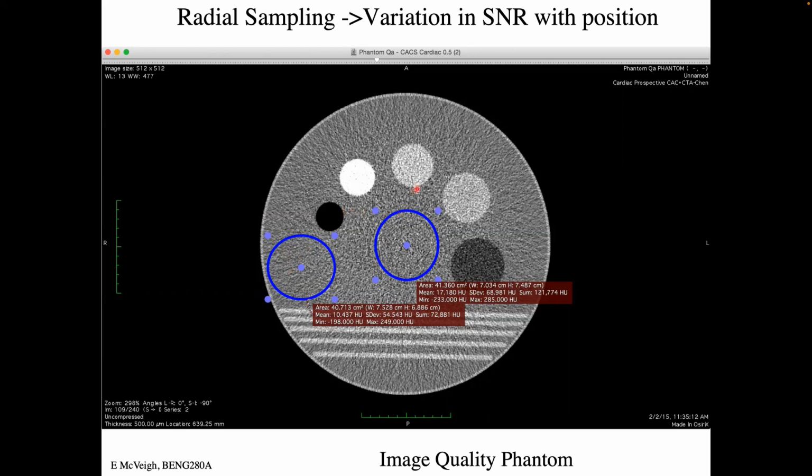And it's pretty obvious, at least on my screen, and probably on yours too, that there's a structure that has this radial streakiness to it in the estimate of the water background here. Whereas in this other region, if there's a structure, there could be some kind of correlations in a circular way, but it doesn't look like there are radial streak structures here.